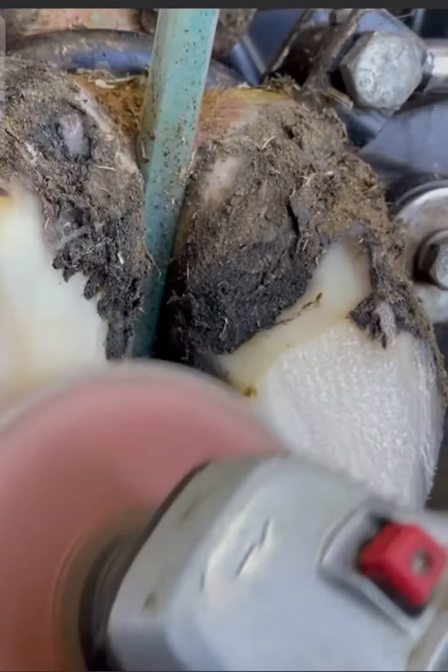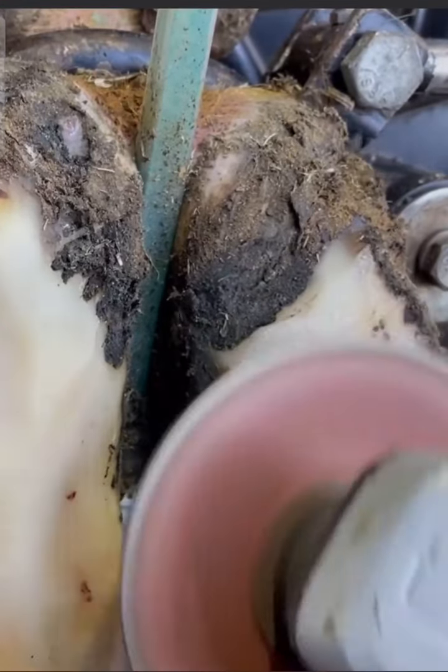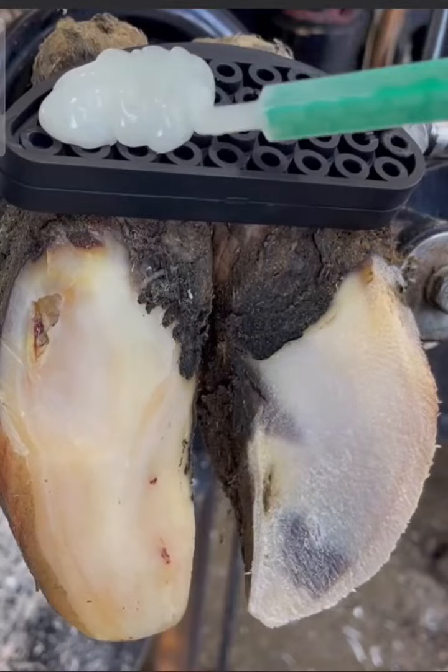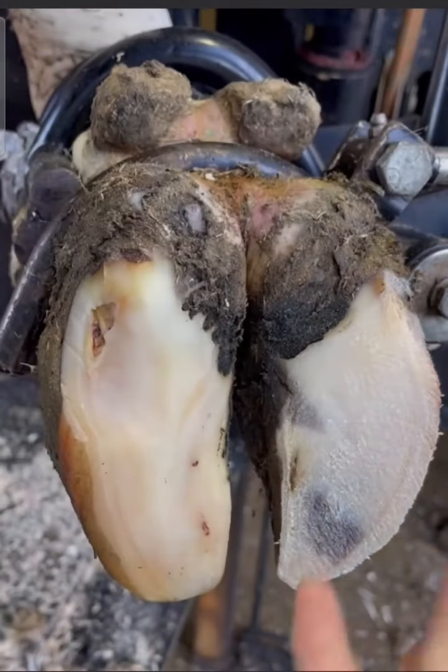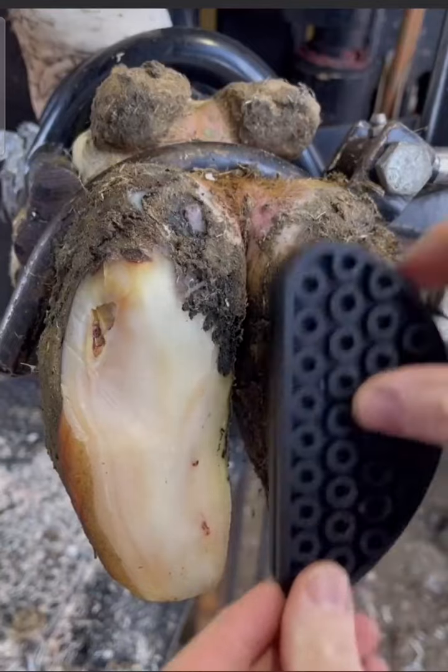Now we need to prevent her from putting any weight on this particular claw. In order to do that, we're going to glue a rubber block on the other one. That's going to elevate the injured claw, putting all of the weight on the good claw. The rubber block is going to act like a little bit of a crutch.